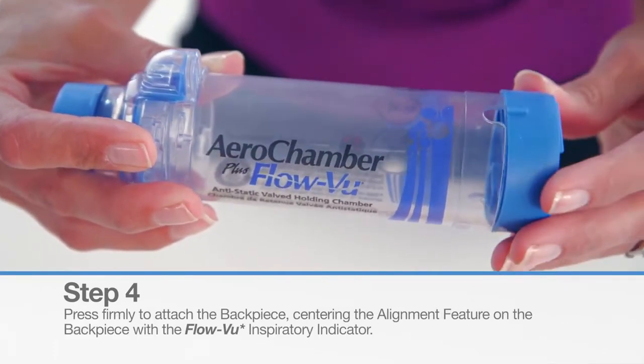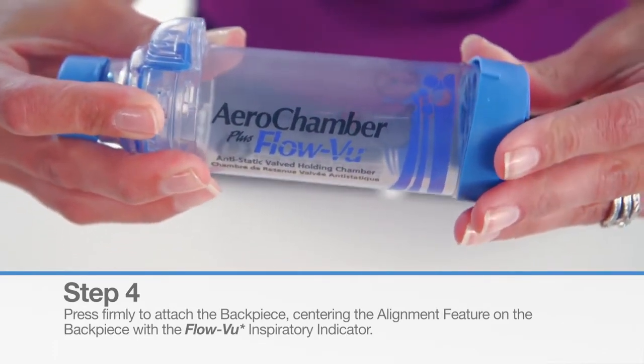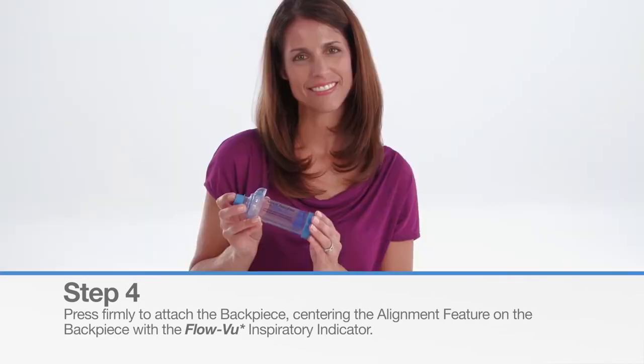Press firmly to attach the back piece, centering the alignment feature on the back piece with the FlowView Inspiratory Indicator.